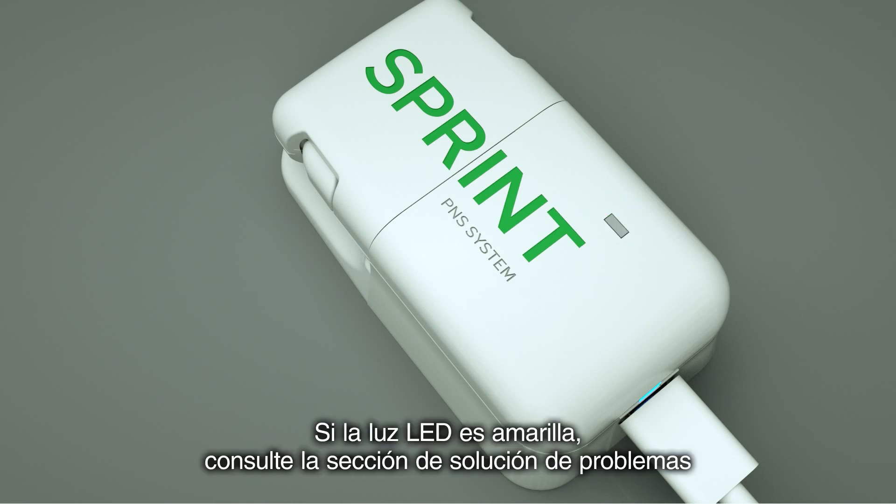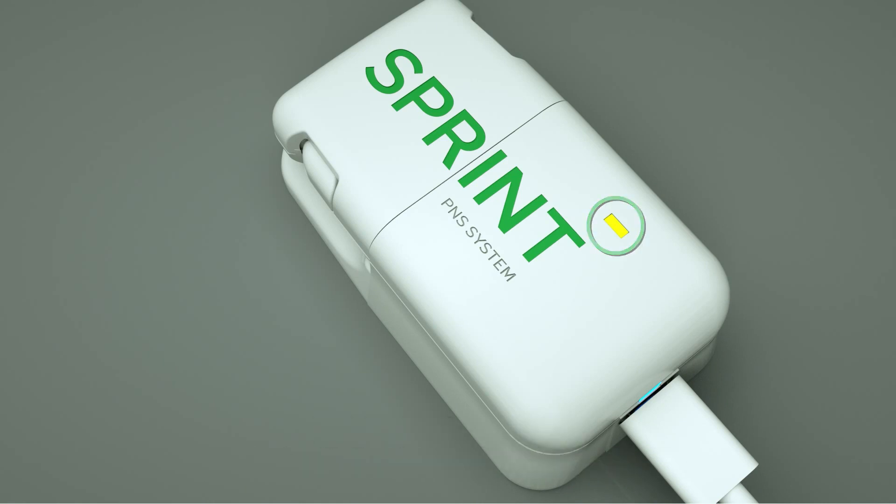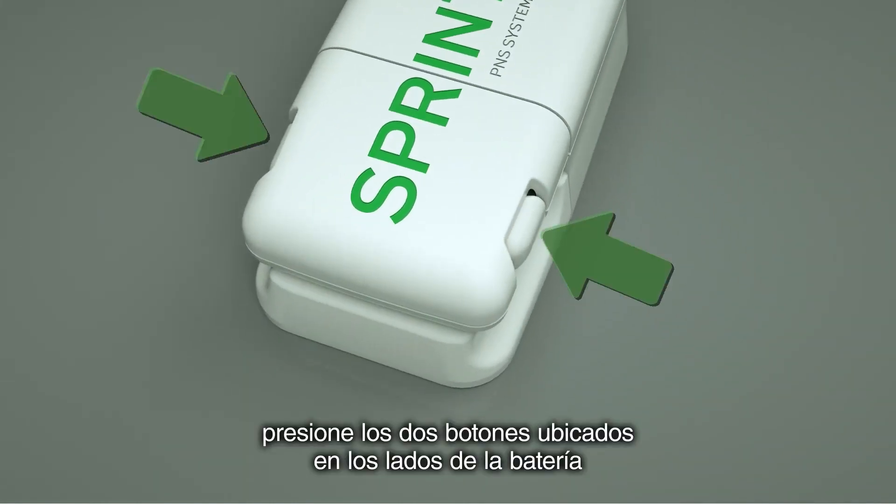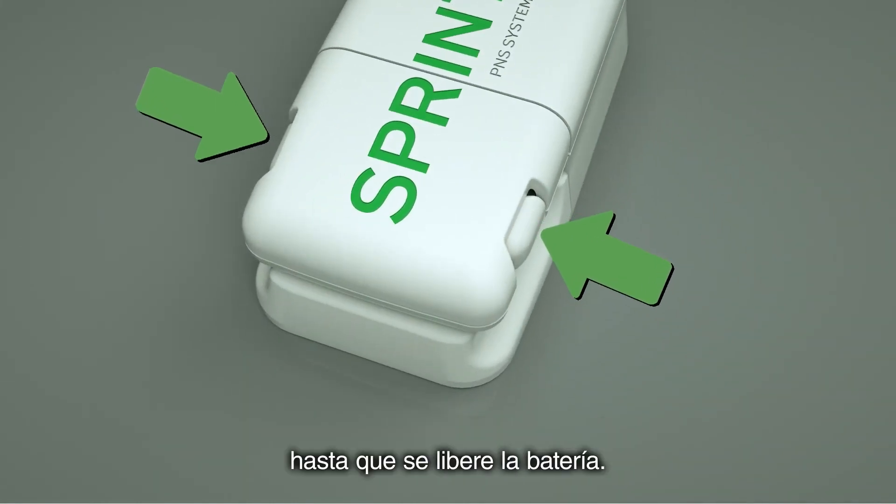If the LED light is yellow, refer to the troubleshooting section of your instructions for use. To remove the battery from the recharging base, press the two buttons located on the sides of the battery until the battery releases.